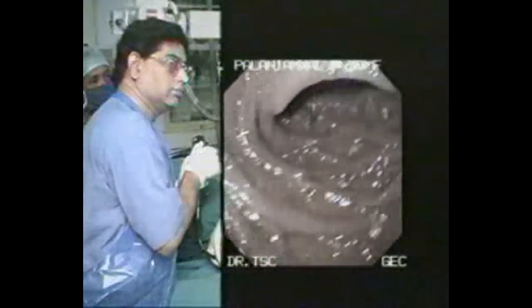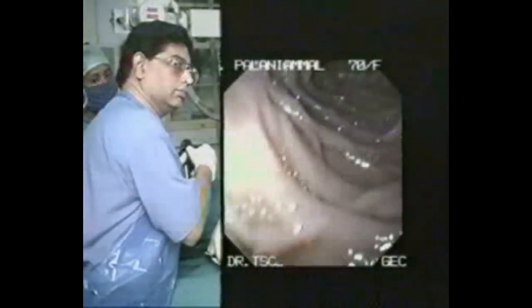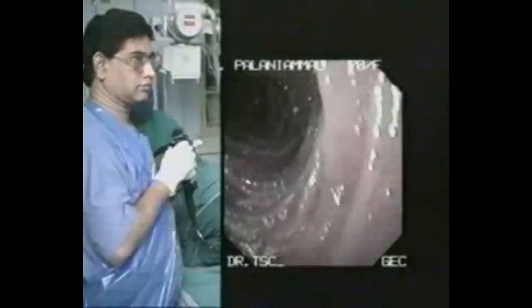Entry into the third part of the duodenum, as you are watching with difficulty, is possible by turning the body to the left, with the bigger wheel down and the smaller wheel to the left.